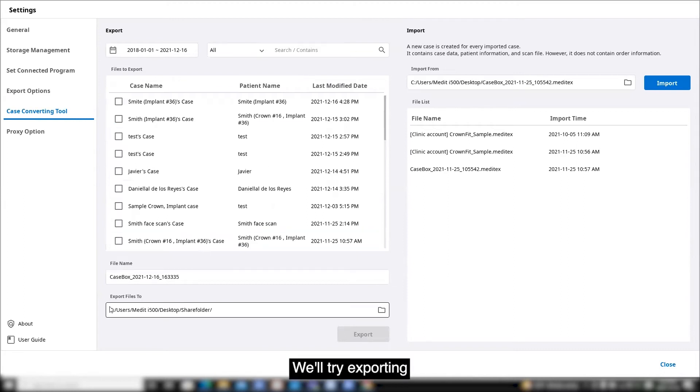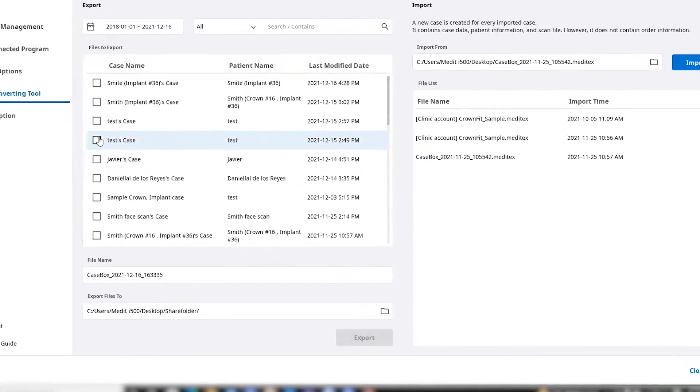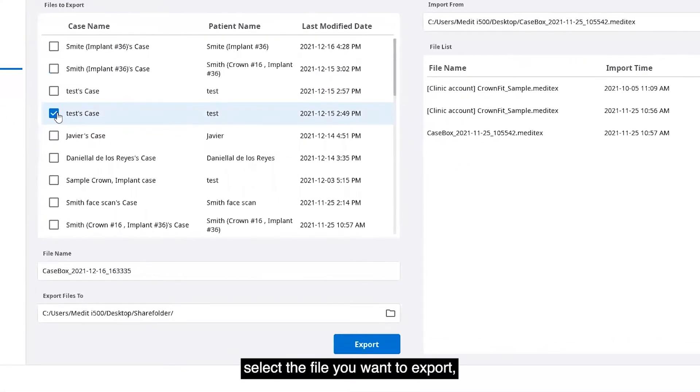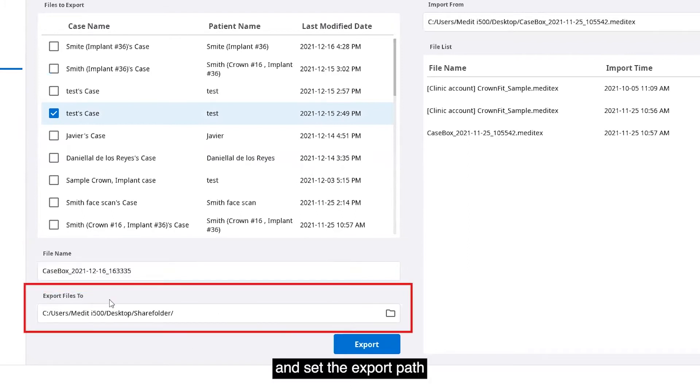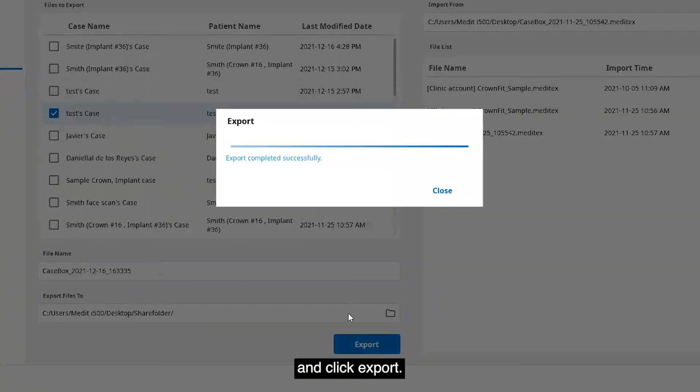We'll try exporting first. Select the file you want to export, enter the file name and set the export path, and click export.